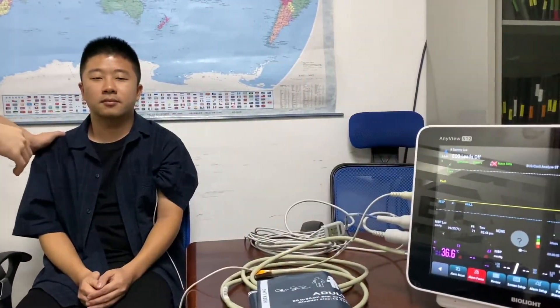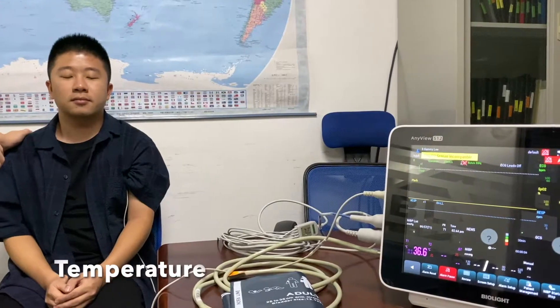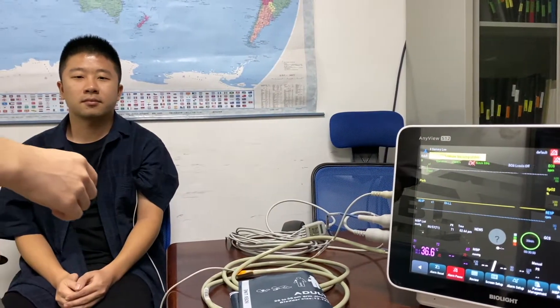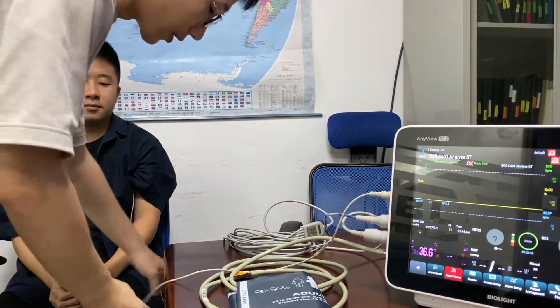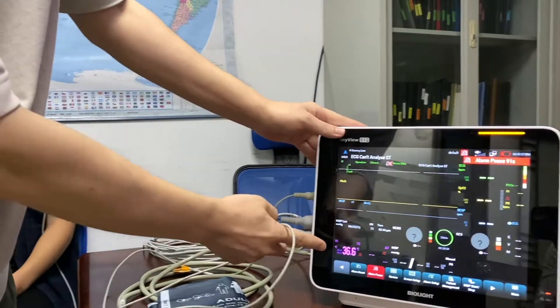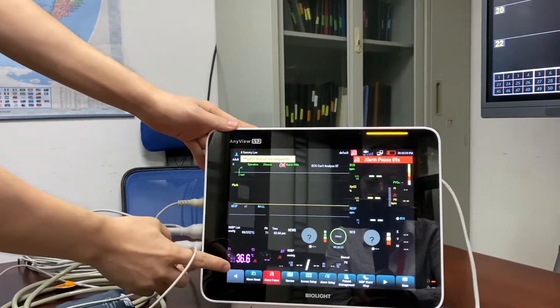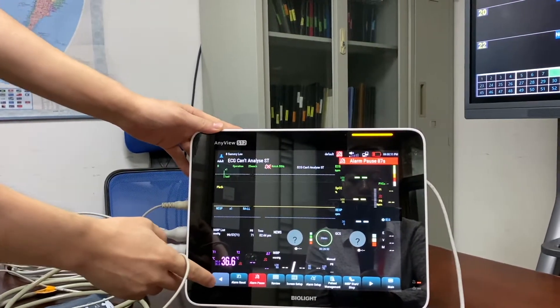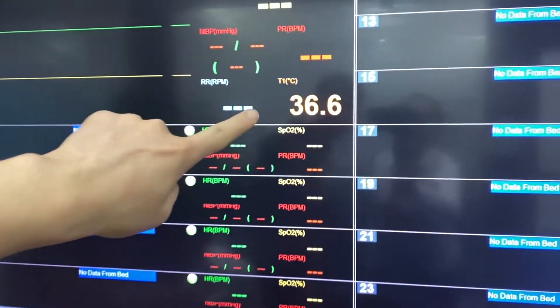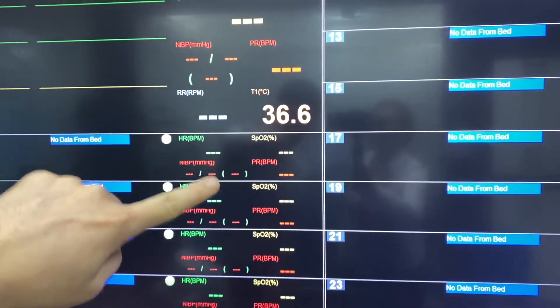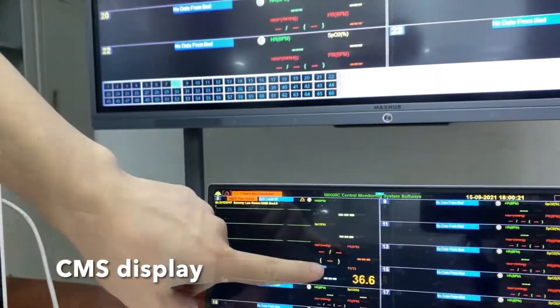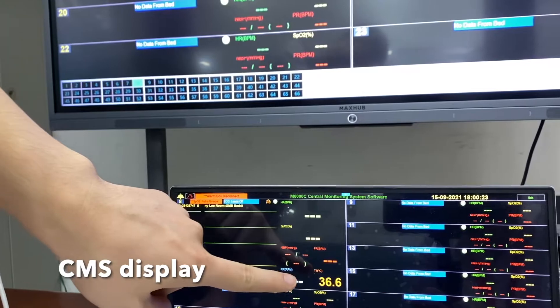Currently we have a patient using our temperature probe. Once we connect the patient's temperature accessory, we can see the real-time temperature here which is 36.6 degrees. In the CMS we will also be able to see the reading, and on the external display you can also see 36.6 degrees.